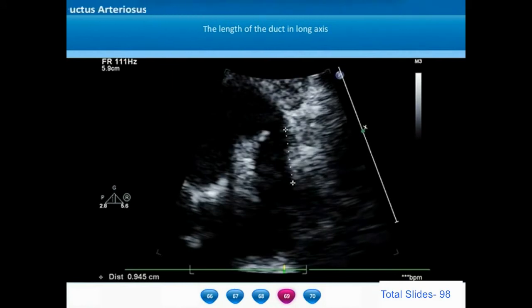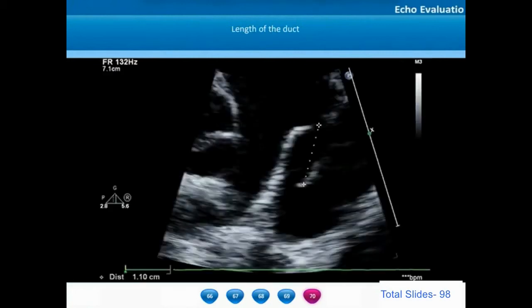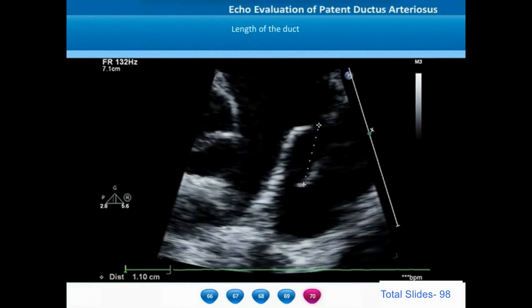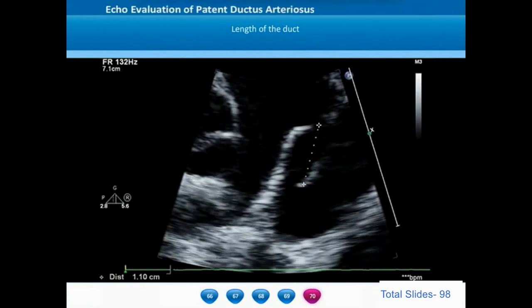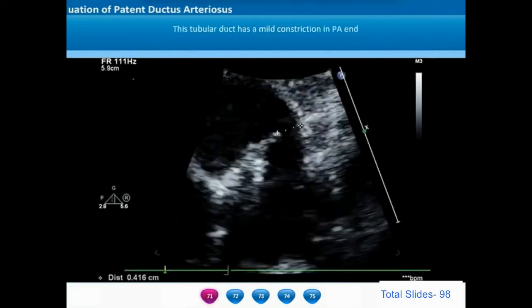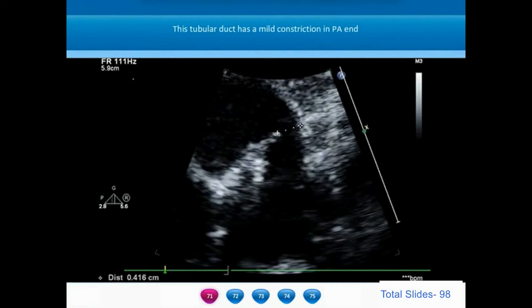In this example, the length of this long tubular PDA is close to a centimeter. Measurement of another tubular long PDA shows the length close to 11 mm. Some tubular PDAs may have a very mild constriction of the pulmonary artery end, which also needs to be noted to identify the strategy of closing these ductus by intervention.